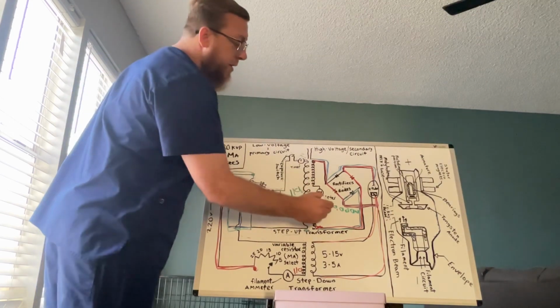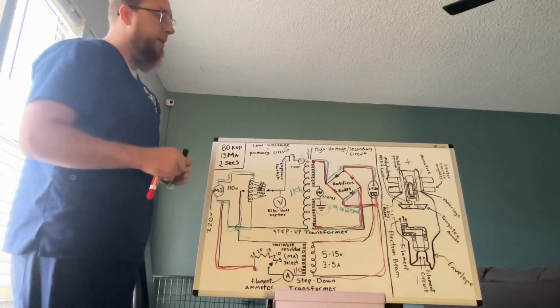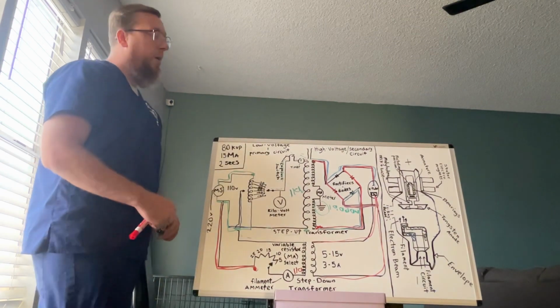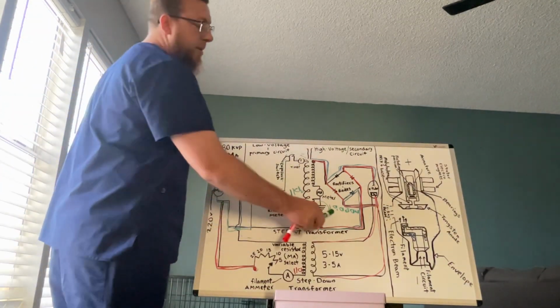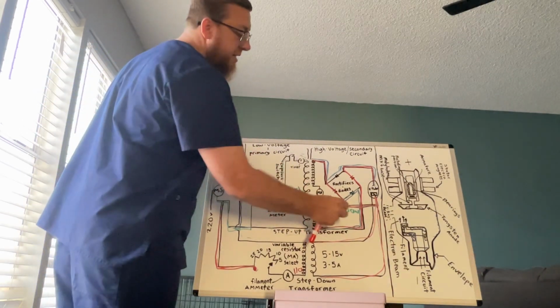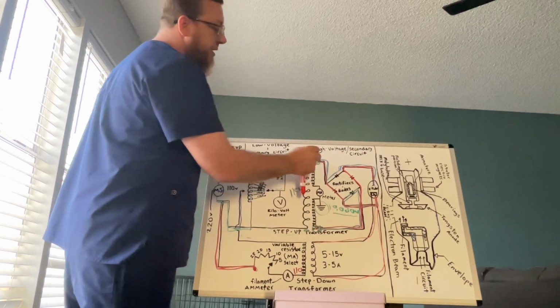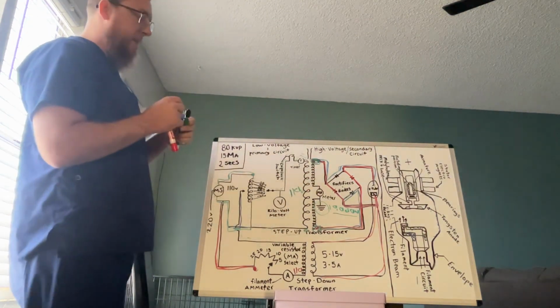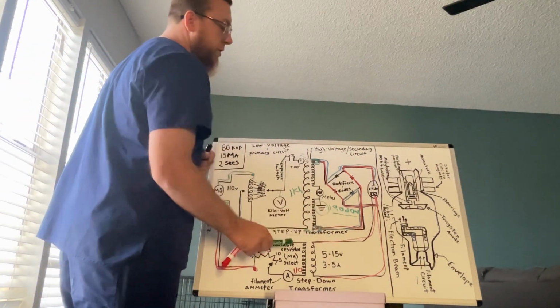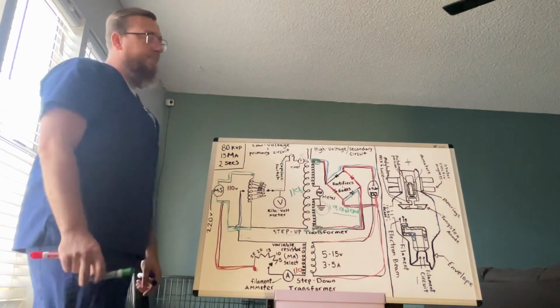Right here is a ground, and this is a safety measure that's put into the circuit so it doesn't overload the circuit. It's going to sit in this ground, and again, it won't be used. Once we get the correct amount of 10,000 volts, it's going to sit in capacitors that are typically around this area. It's not on the diagram, but I'm going to add that in there. So for now, we're just going to pause and say 10,000 volts, the correct amount read by the meter, is going to sit in our capacitors.